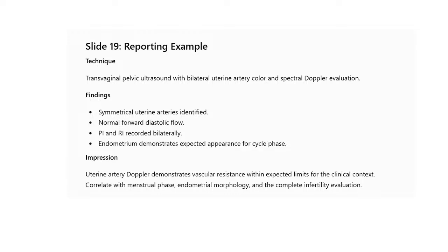So the impression: uterine artery Doppler demonstrated vascular resistance within expected limits for the clinical context. Correlate with the menstrual phase, endometrial morphology, and the complete infertility evaluation.